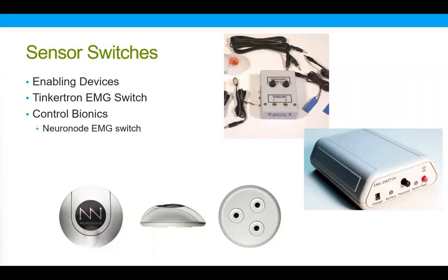These are fussy switches. They can be challenging for a caregiver to calibrate when placed on a client. And so I consider these personally a last resort switch. You want to use this only if nothing else will work, because they are, again, very expensive. It's important to rule out less costly options if we're getting funding for this. And also to not recommend something that requires a lot of fussing for caregivers if something else is a little more foolproof. If something's difficult to use, I have too many clients where it may not get used at all. And our goal is use. We want our client to be able to access their technology.